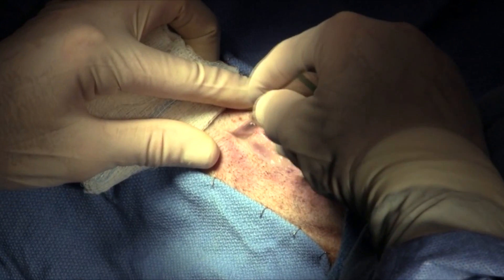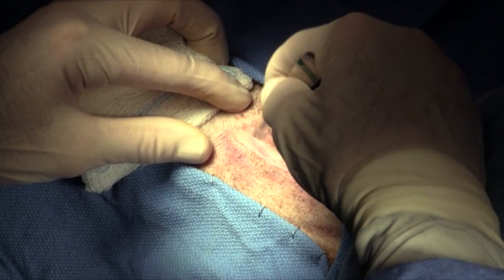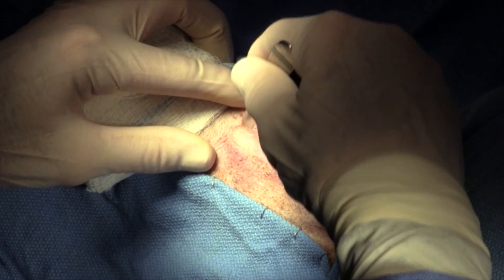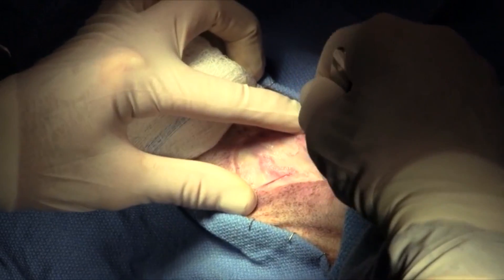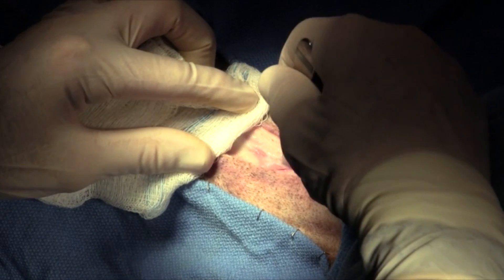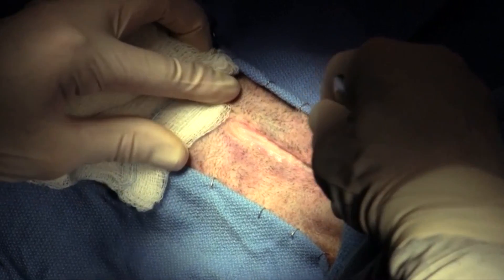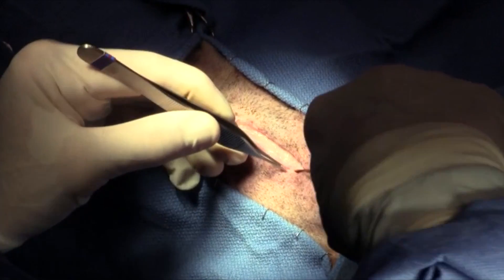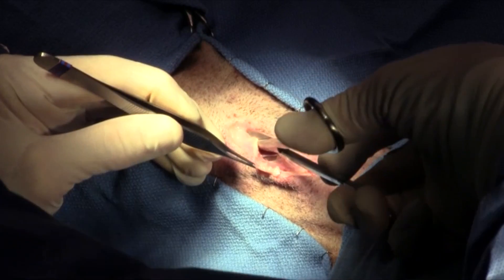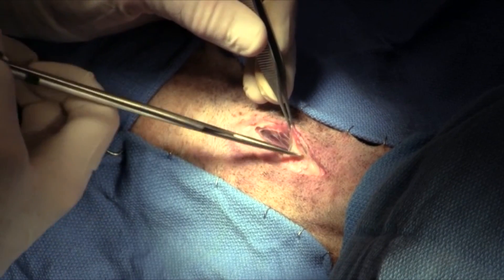Subcutaneous tissue is sharply incised and the goal is to stay midline to the trachea. In an emergency, sharp incision through the sternohyoid muscles may be accomplished without fear of damage to any major structure. In this demonstration, a more controlled incision on the midline is being attempted.